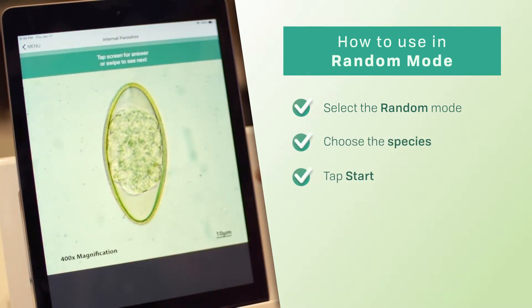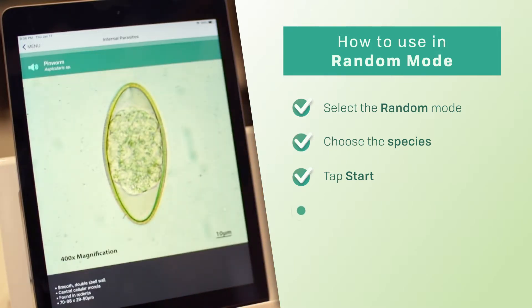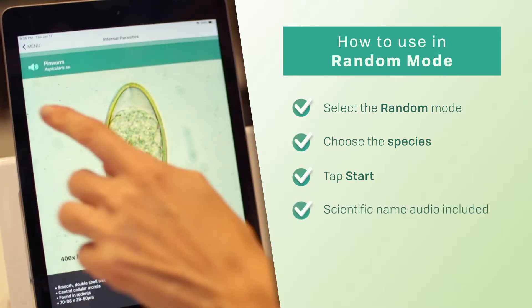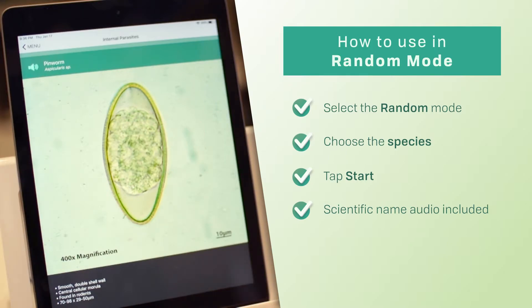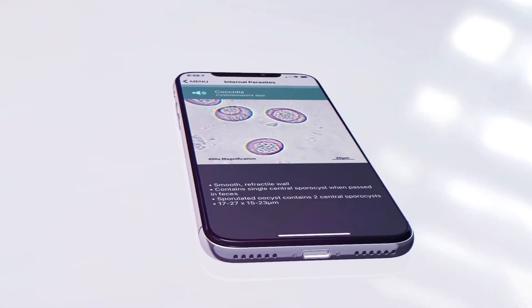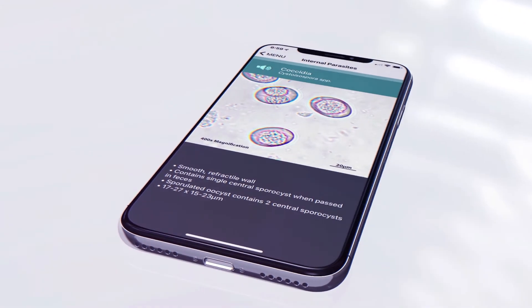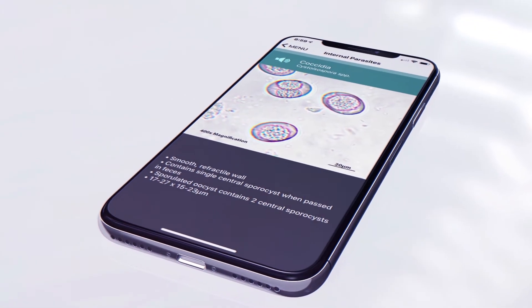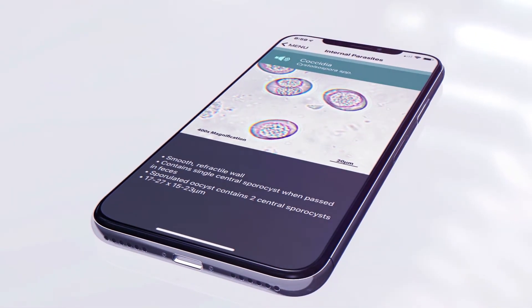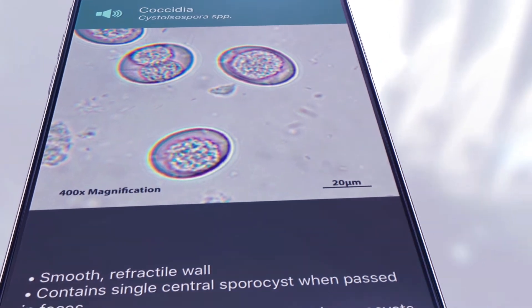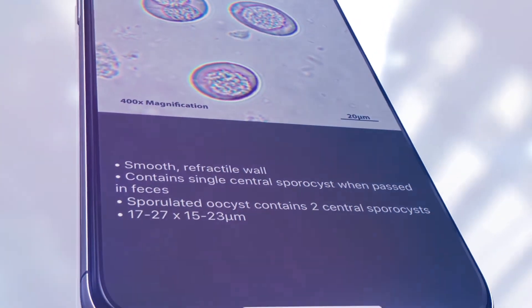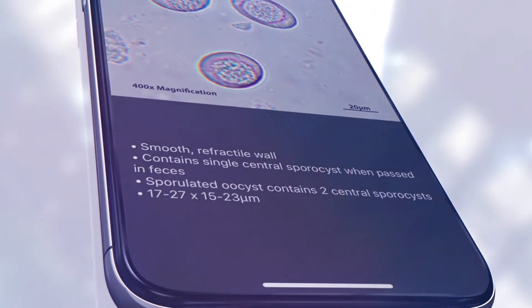The app is set up in flashcard-style mode, and audio recordings are included for the scientific names. Challenge yourself or your teammates to correctly identify both common and less commonly seen parasites and their characteristics. This is an imaginative way to become the expert at fecal parasite identification in your practice.